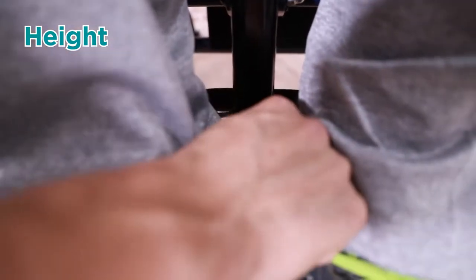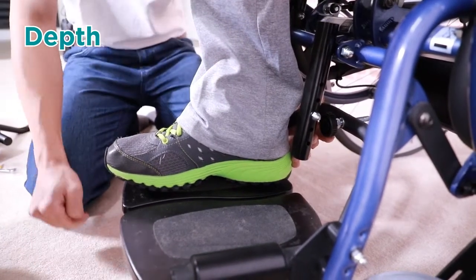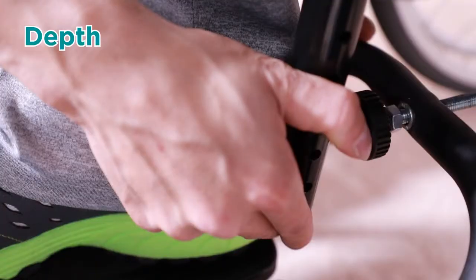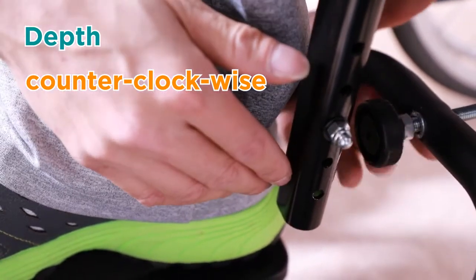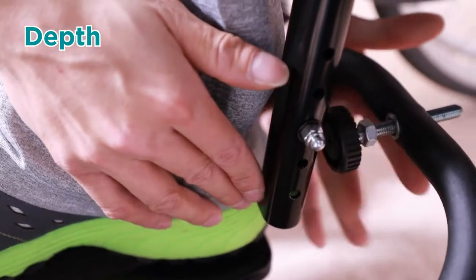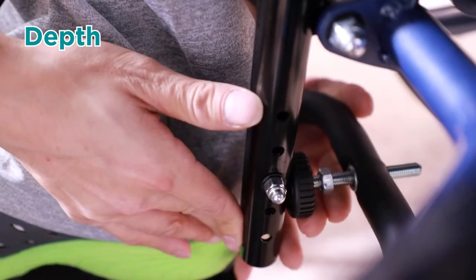Use a simple tool to unscrew them and adjust to where you like the pads to be. When adjusting the depth of the knee support, we need to leverage this knob. Now if I want the knee pad to be placed closer to the user's knee, I will screw the bolt counterclockwise and press this base until it touches the knob.